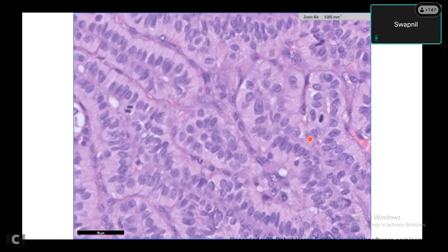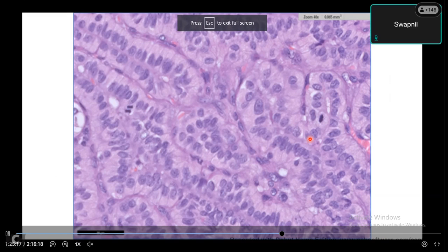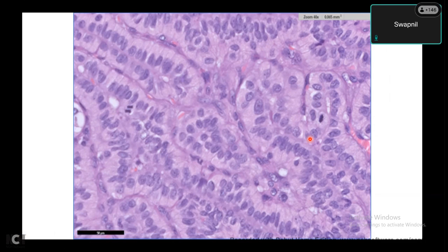And if these aggressive patterns are not there, then you talk of all the differentiated tumors, whether differentiated PTC, or encapsulated variants of whatever tumor, or differentiated follicular carcinoma and things like that. So your entire approach has to start from trying to identify these high-grade tumors very accurately and not miss them. Because no matter what the pattern and what the cell type, if you find any of these high-grade features, they have to be pushed into high-grade thyroid carcinoma or PDTC or anaplastic thyroid carcinoma.